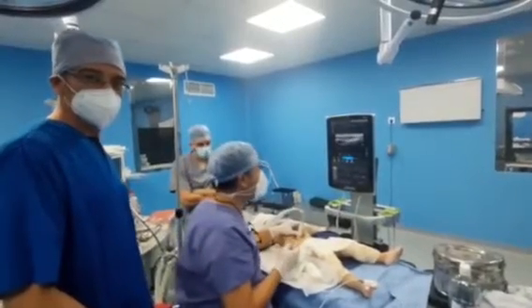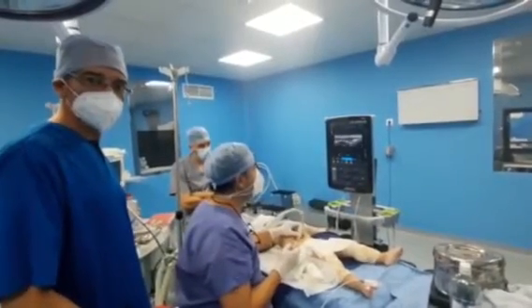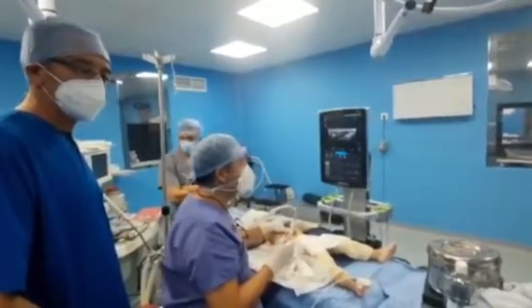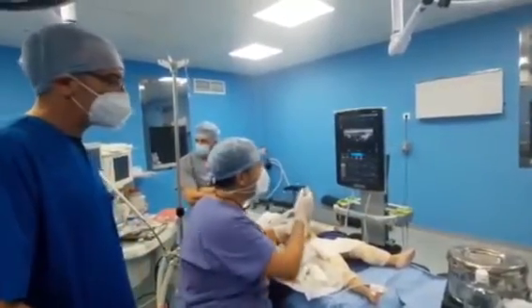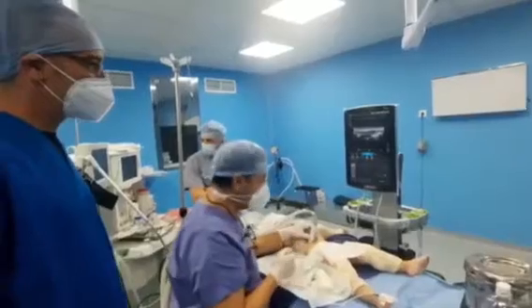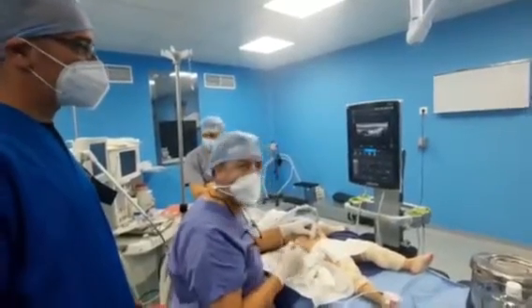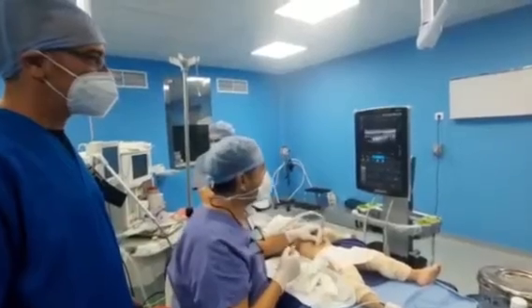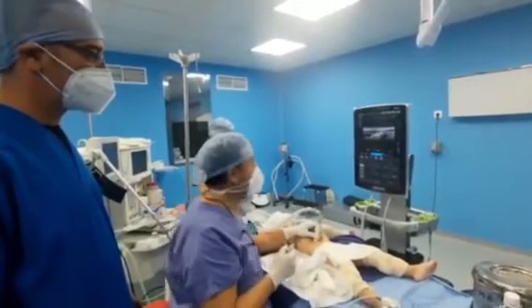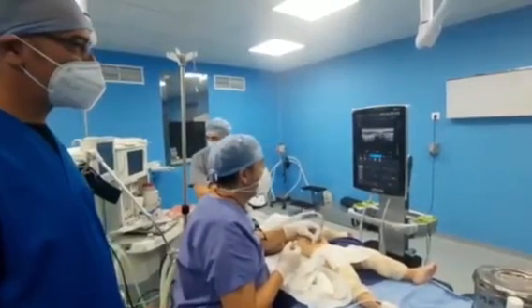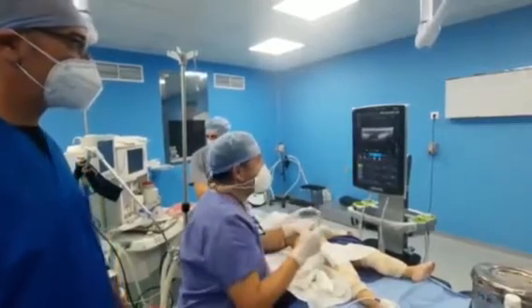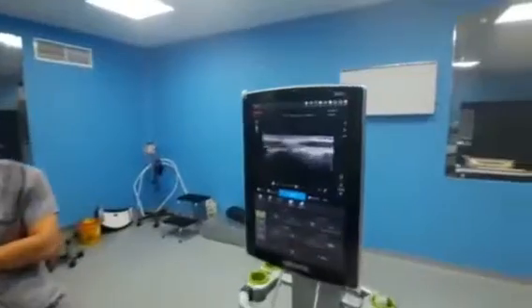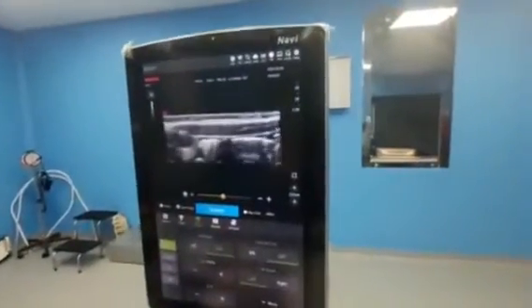Hello everyone. Today we are performing a rectus sheath block in a child, two years old, for the umbilical area. You can see on the screen the sonoanatomy of this block.